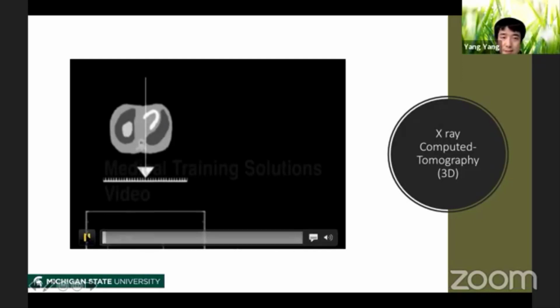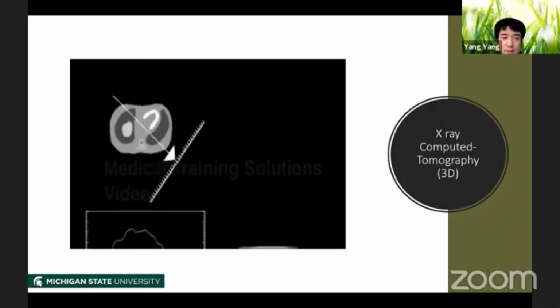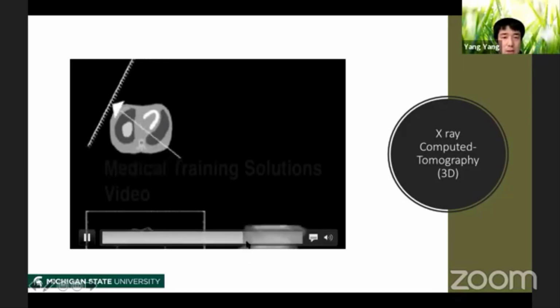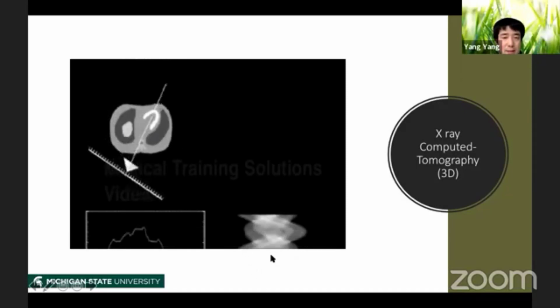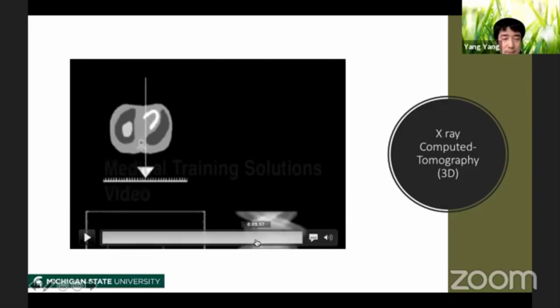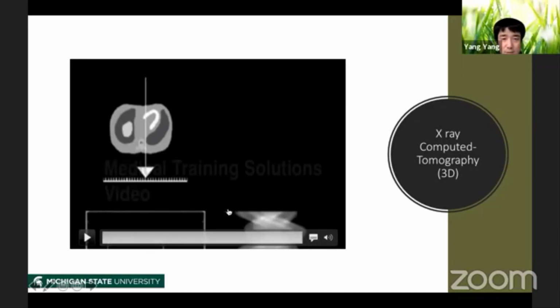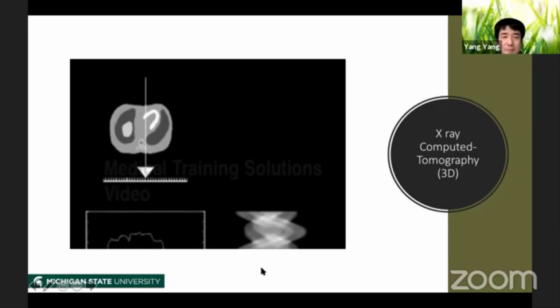So let's watch this video again. It gives a very clear illustration of how it works. Now we see that every time we get a shadow, we place the shadow as a slice here, and then we stack all these slices, and we get an image like this. Of course, this is not the image of the body itself, right? But there is some information about the body inside this image.